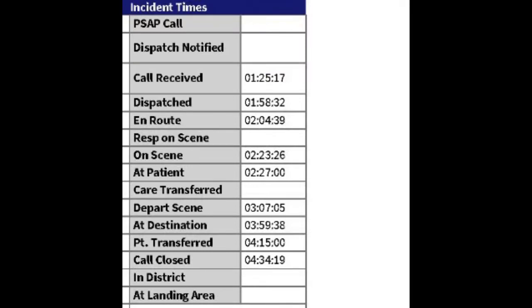Now, there might be people saying, well, what's the big deal? He had chest pain. He went to the hospital. They figured out that he needed to go to definitive care, and so they called an ambulance and they had him transported elsewhere. Well, the big deal is this. The first 12 lead, in which you might have interpreted STEMI, was done at 1946. The hospital called us to come get the patient at 0125. That's 5 hours of sitting on top of a STEMI.